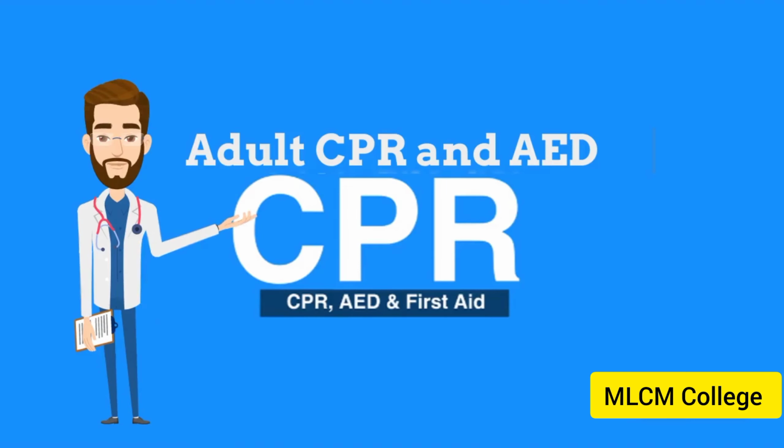Skills Training about Adult CPR and AED. Part 51, Adult CPR and AED. Welcome to the lesson on Adult CPR and AED. In this video, we will discuss Adult CPR and AED.